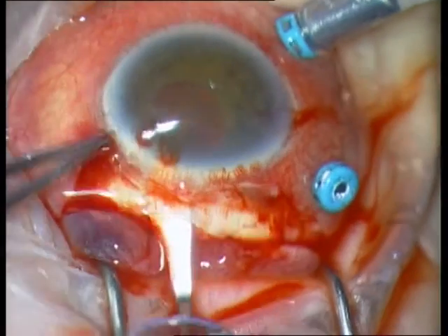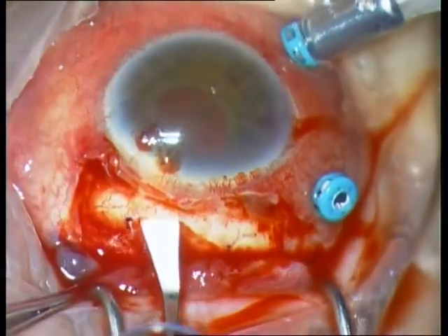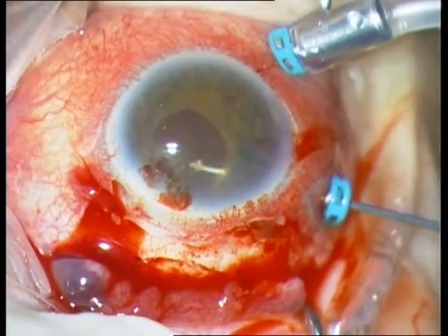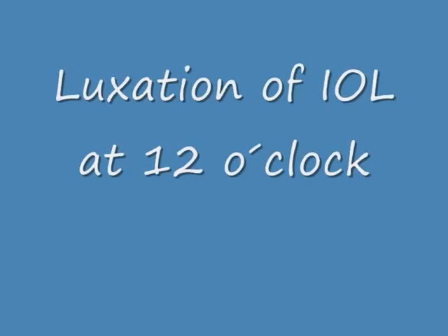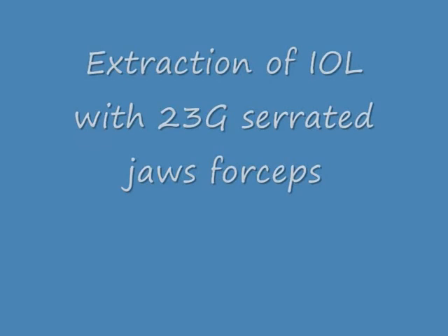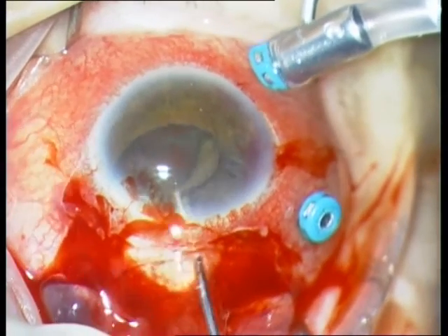Otherwise you will have an iris prolapse. Then continue to cut until the marking, which is 6 mm. Now I'm luxating the IOL with the cutter at 12 o'clock. The next step is the extraction of the IOL with a 23-gauge serrated Jaws forceps. This is usually a very easy maneuver.